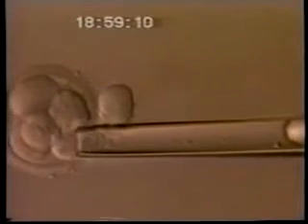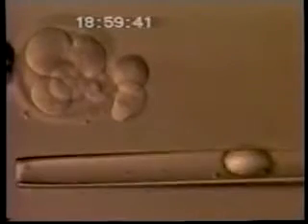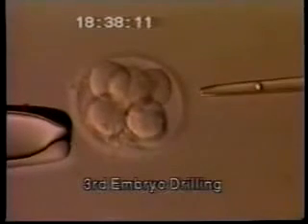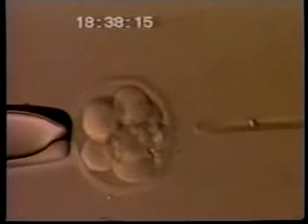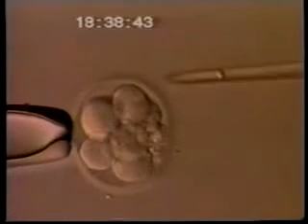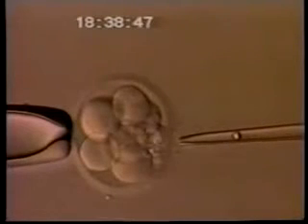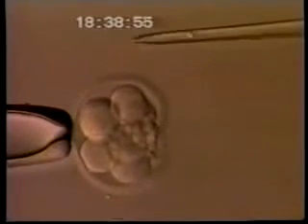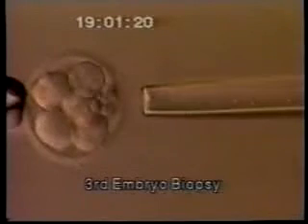You will see eventually, however, that some cells are very difficult to remove because what is called compaction has begun. Now, in these first 2 embryos which we've just biopsied, compaction had not yet begun, so it was relatively easy to remove the two cells without damaging the rest of the embryo. In the third embryo you're about to see, compaction has begun, and there are tighter connections between the blastomeres of this embryo, and you'll see that it is relatively difficult to get the cell out without either damaging the cell itself or the surrounding cells of the embryo. Right now you're seeing that we're carefully making a hole in the outer shell by actually squirting in the usual fashion some acid tyrode solution on that zona pellucida, and once the hole has been made, then we get the embryo reoriented so that we can place a much larger pipette through the hole.